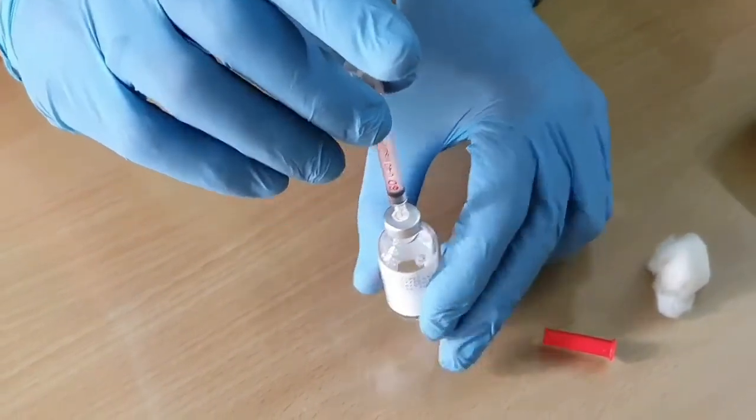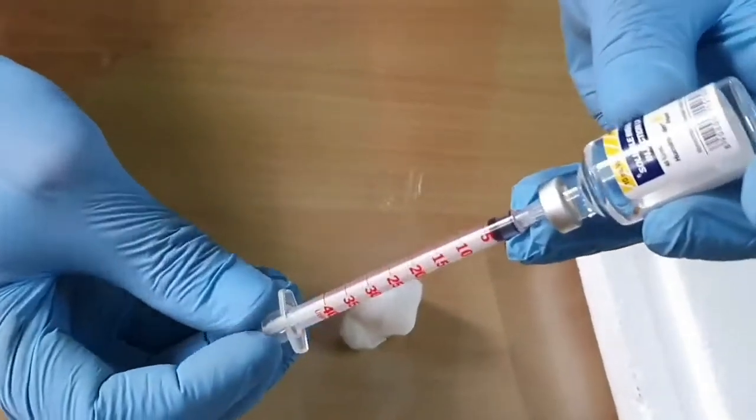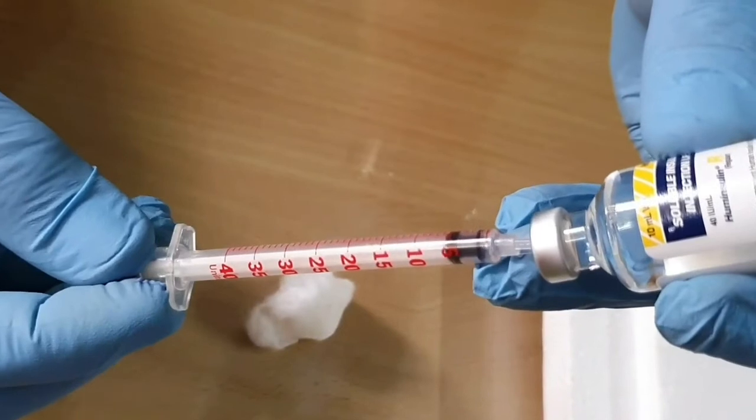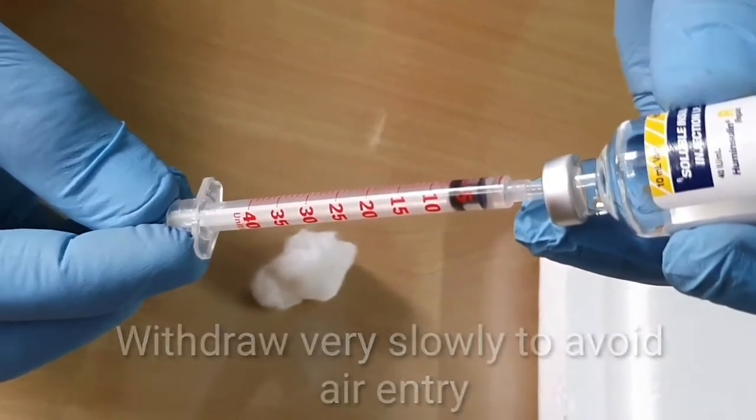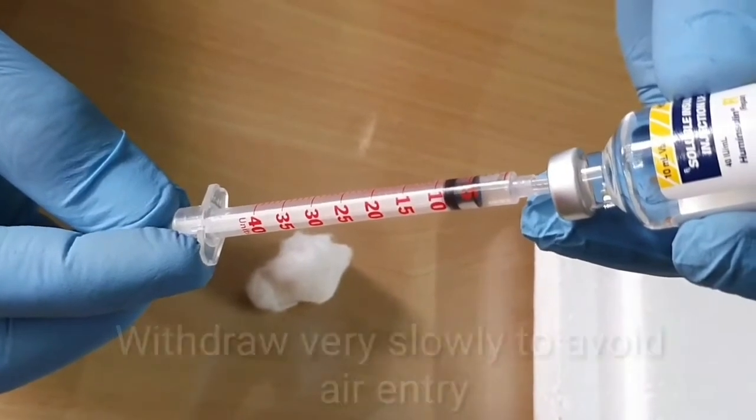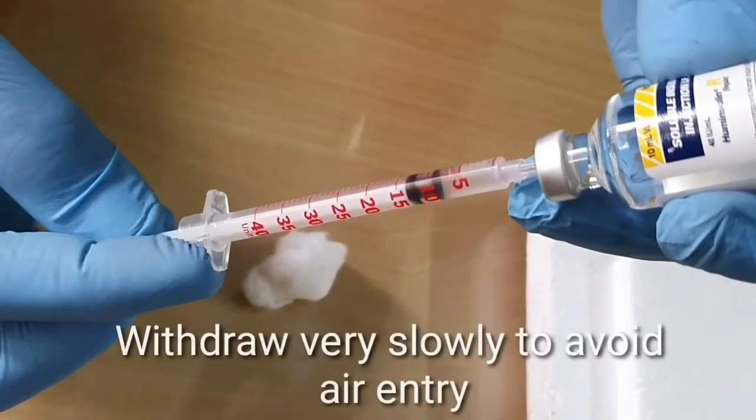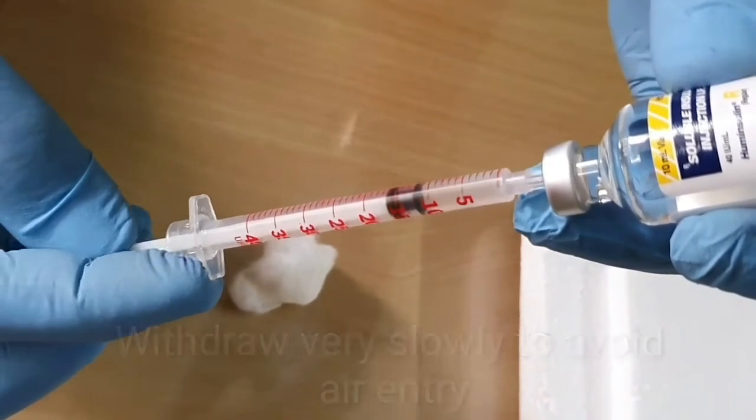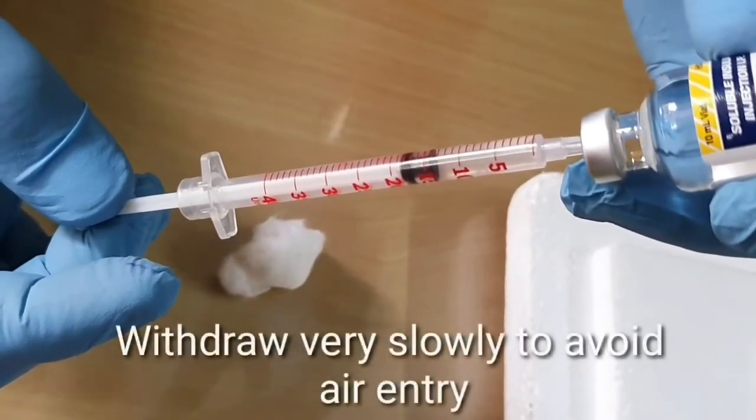Now you hold the bottle upside down and slowly withdraw. When you withdraw, it should be very slow because otherwise there can be a chance of air entering into the syringe. Slowly, see, now I've got to 5, 6, 7. I've reached 10, and now 11, 12, 13, and 14.